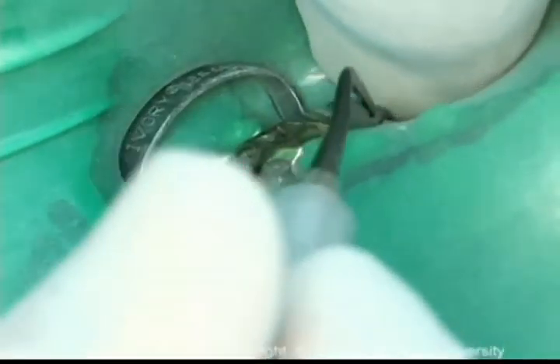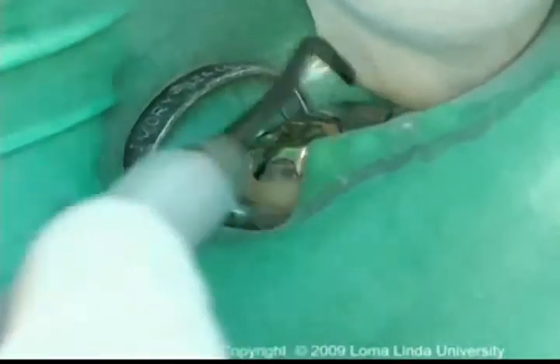The dam is released apically off the clamp wings to allow the dam to constrict around the tooth neck.